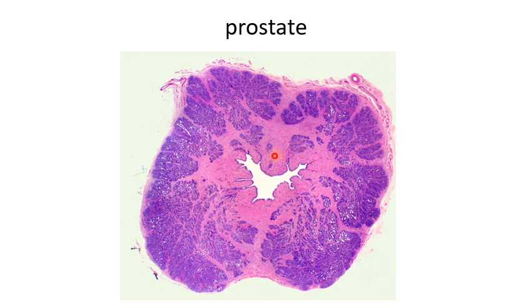You can see the acini present in three zones: small, intermediate, and large acini in the mucosal, submucosal, and peripheral regions. Here are the fibromuscular septa, alternating light rose and dark pink fibromuscular trabeculae or septa.